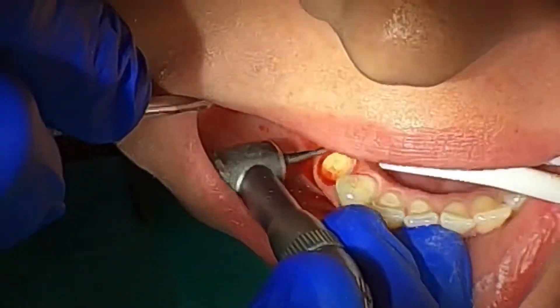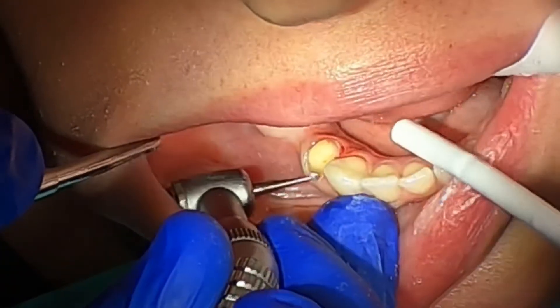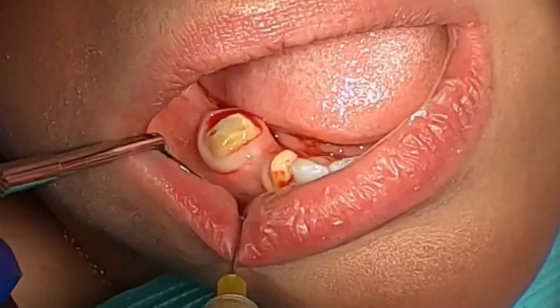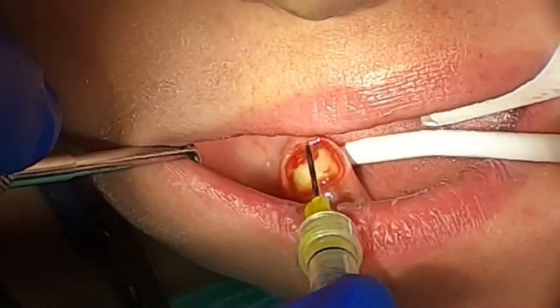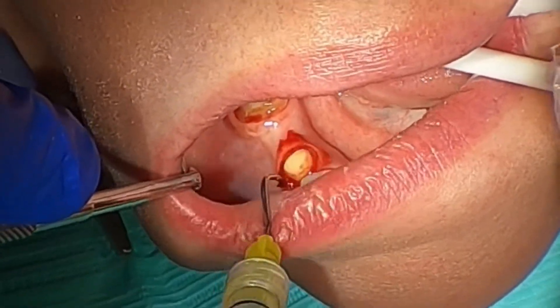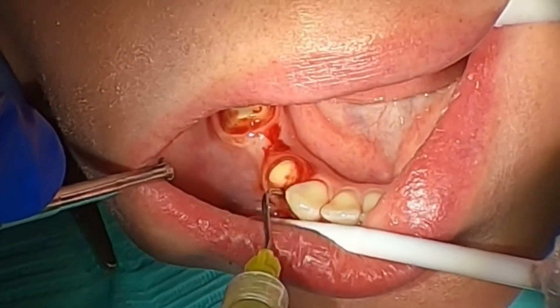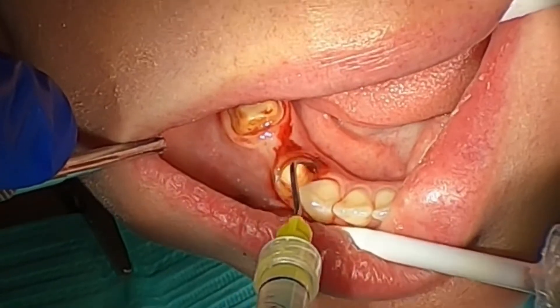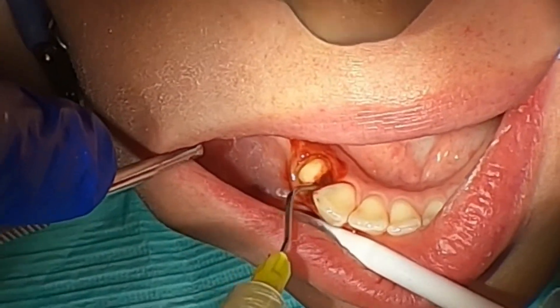I've been using CEREC since 2006 and I'm pretty quick at it compared to my dental assistants. I trust several of them to do the CEREC design, but I'm much faster, so there's value in the time saved — taking three to five minutes designing a crown or five to ten minutes designing a bridge versus them taking 30 minutes or an hour. Dentists generally have a better grasp on occlusal anatomy and interdigitation of the opposing arches.